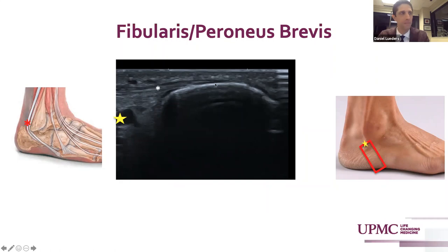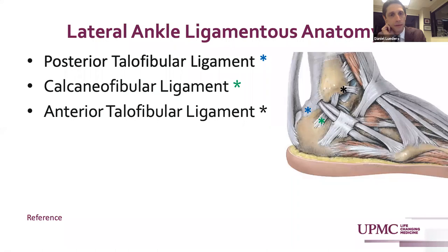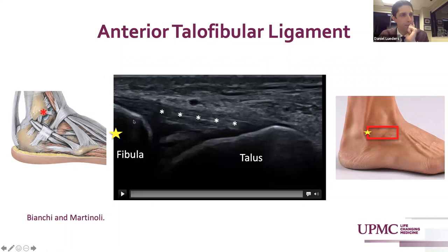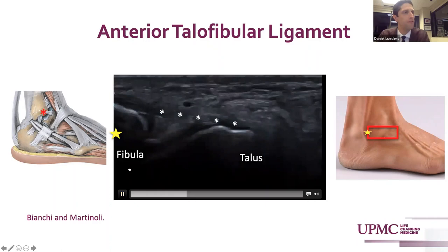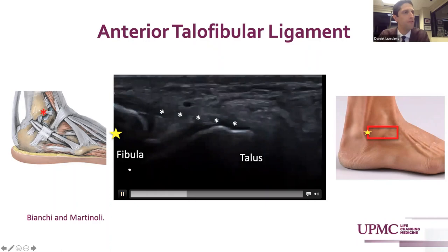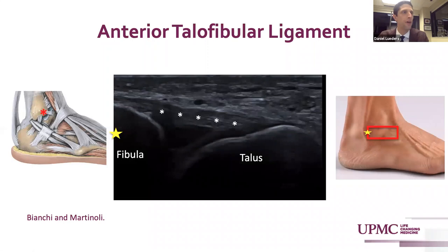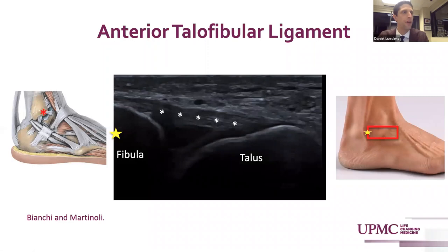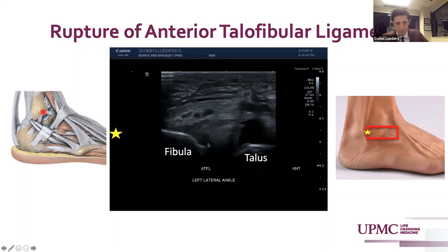Moving on then to the lateral ankle ligamentous stabilizers. The three most prominent and visible structures are your posterior talofibular ligament, your calcaneofibular ligament, and your anterior talofibular ligament. The anterior talofibular ligament is the one most often injured — it's the most anterior structure that bridges from the anterior fibula over to the talus. It is relatively broad, about five millimeters, so performing a dorsal-plantar sweep will help to fully assess for pathology. In this image we see a full thickness disruption of the anterior talofibular ligament with no bridging fibers from fibula to talus, and a rather large effusion distending the lateral joint recess.